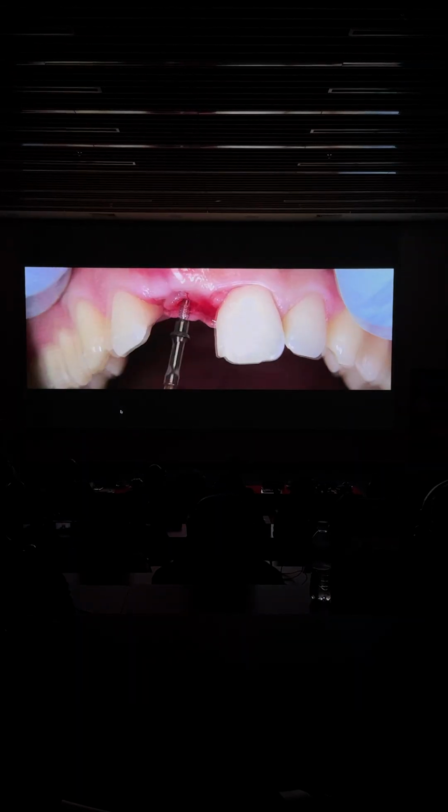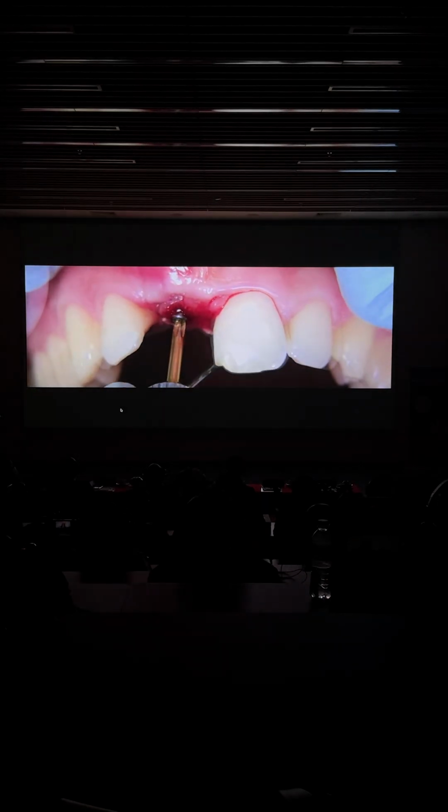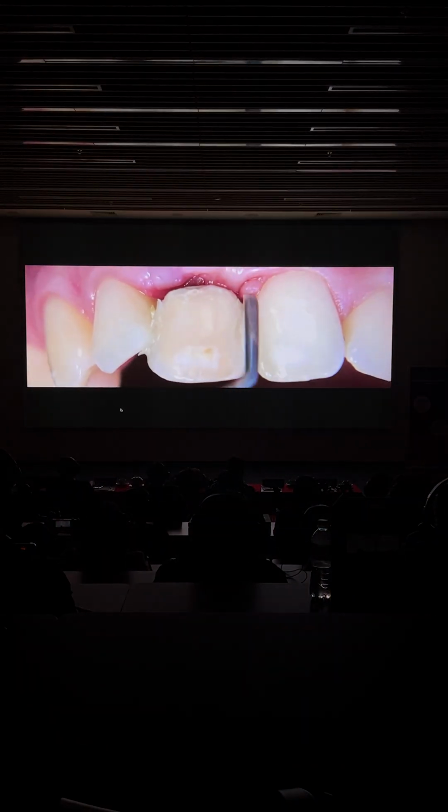In this case, I was lazy, so I placed the same one. So I was faster, I didn't have to realign my provisional. And then in the lab, I'm going to show you how we have to bond back again the tooth. So the patient is wearing something while we are doing the provisional restoration.